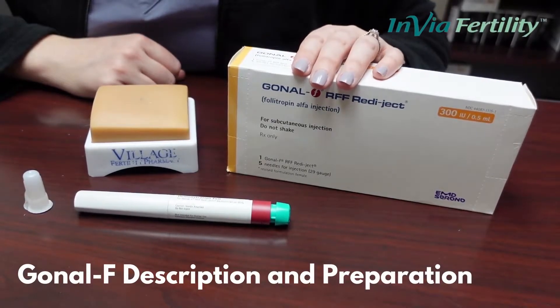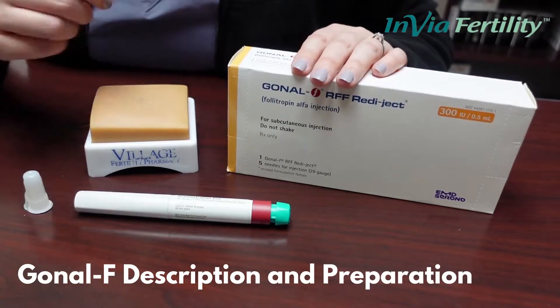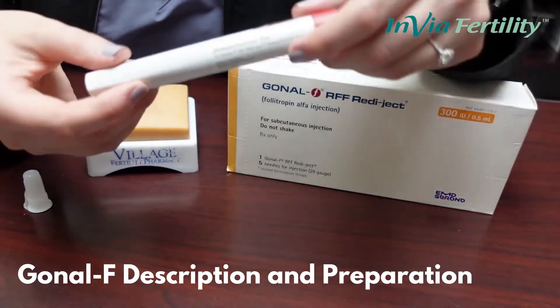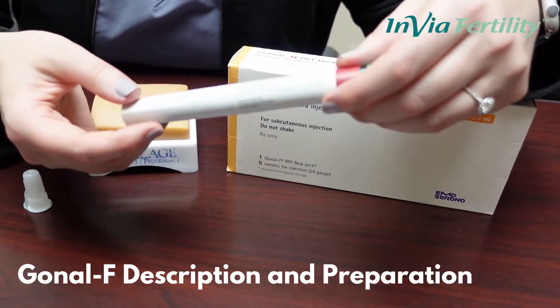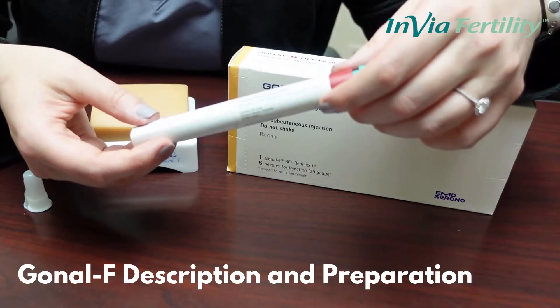Here we have Gonal F, which is one of your stimulation medications. Gonal F comes in a pre-filled, often multi-dose pen and is kept refrigerated, so please after use put it back in the refrigerator until the next time that you use it.